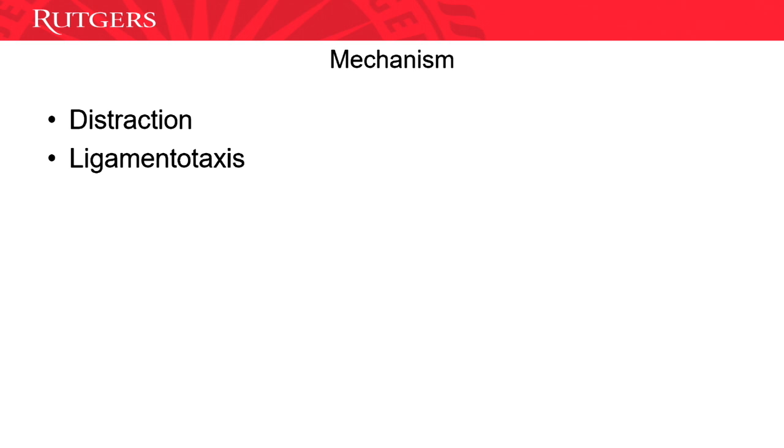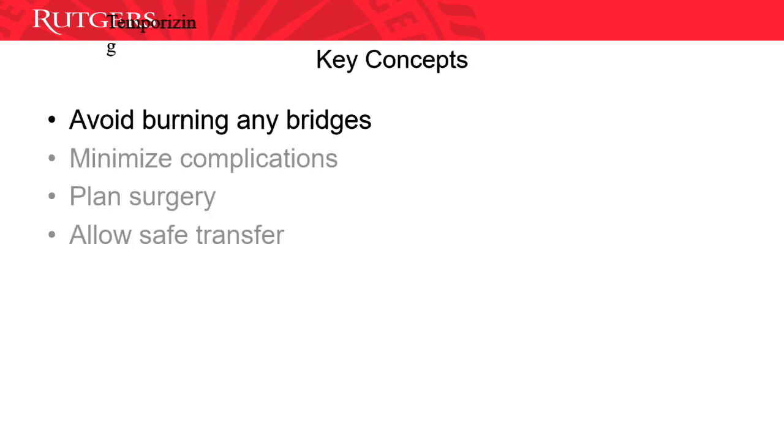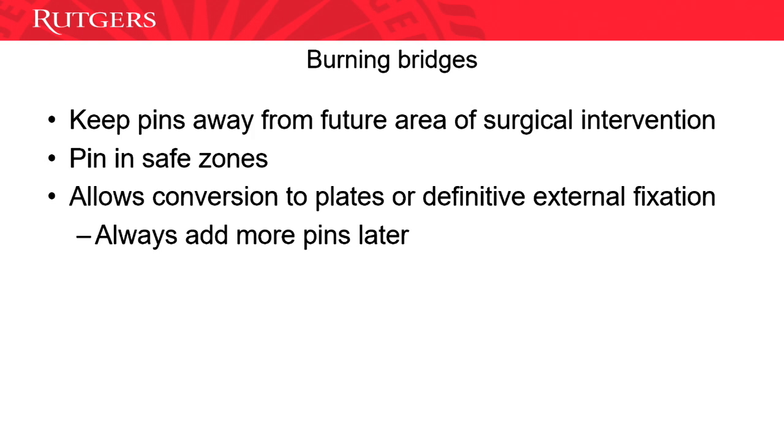Again, you can tolerate a little bit more alignment, which is not perfect, more so in the upper extremity because you have a much more mobile shoulder, elbow, so you can get away with it a lot more compared to the lower extremity. Treatment is, you know, each fracture is based on its personality. Avoid burning any bridges. Dr. Craig mentioned keep the pins away from your surgical site area. Keep pins in safe zones.